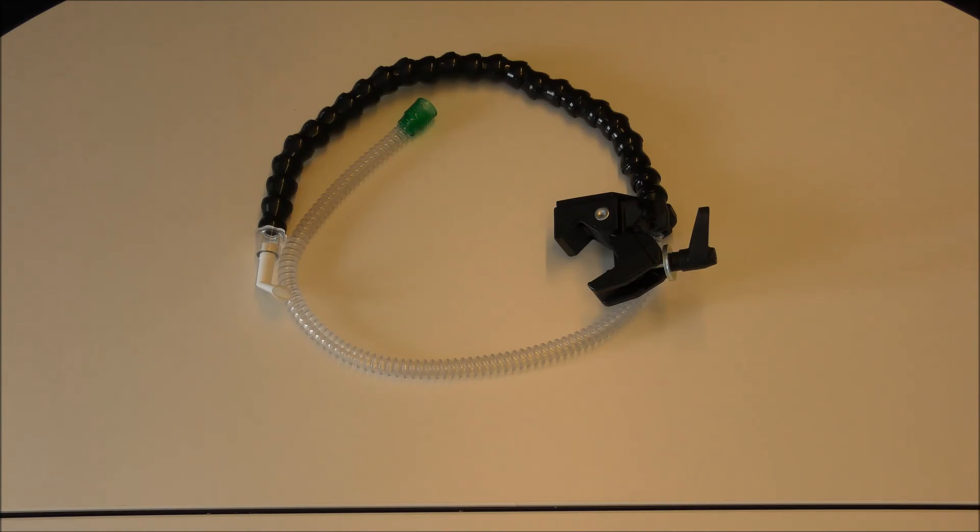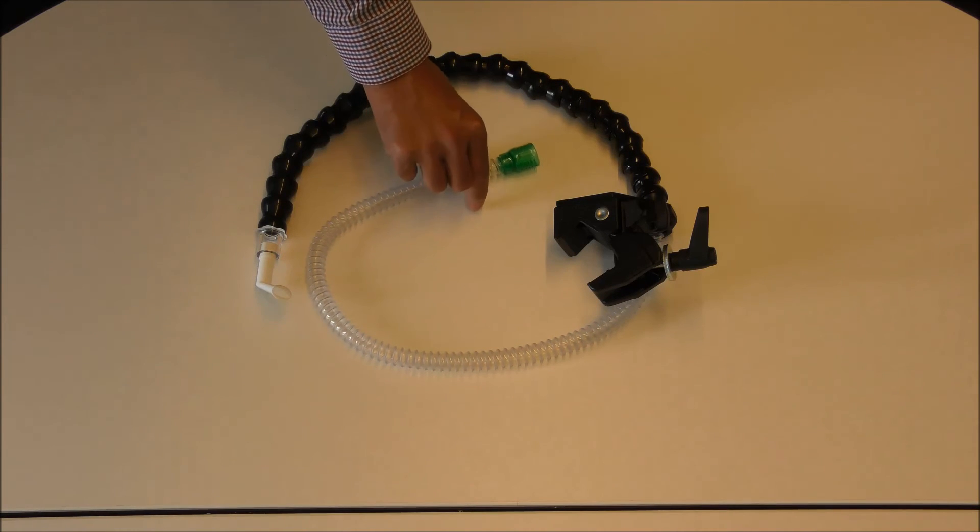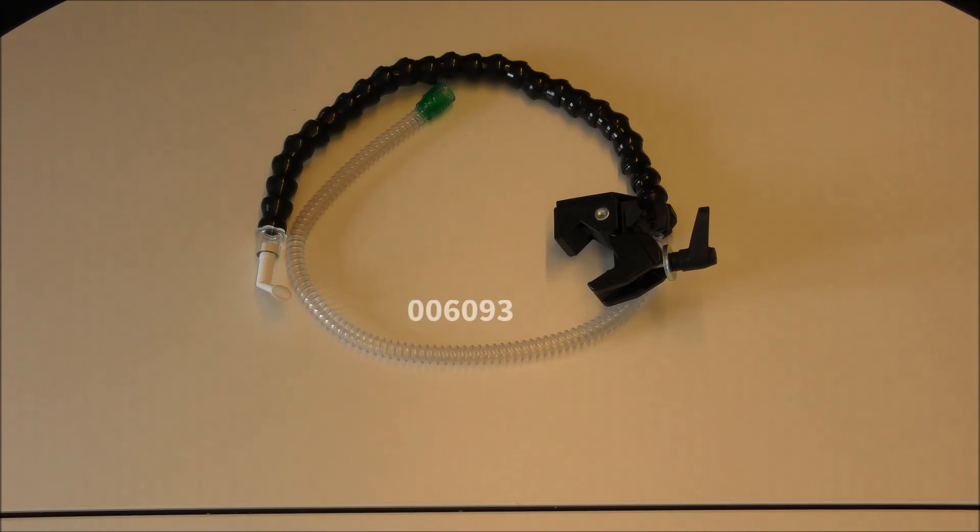Here we see the specific circuit for use of mouthpiece ventilation with Vivo50 and the Vivo60 ventilators. The circuit has part number 006093 and the arm has part number 006095. For more information, please refer to the tutorial movies made about mouthpiece ventilation.